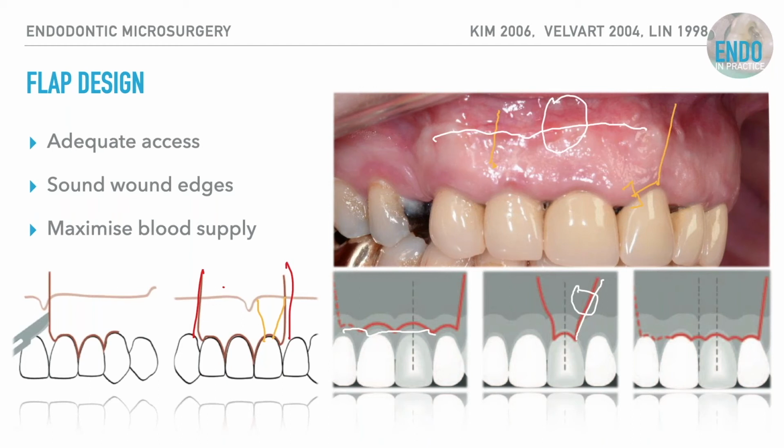But most importantly, the blood and nerve supply for your anterior maxilla comes down vertically like that. If you incise straight across it, you're cutting the maximum amount of blood vessels and neurovascular bundles, and you're increasing the patient's chance of, again, persistent idiopathic dentoalveolar pain. So for that reason alone, it is definitely not a flap of choice.